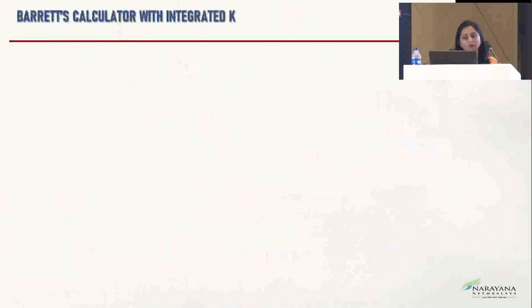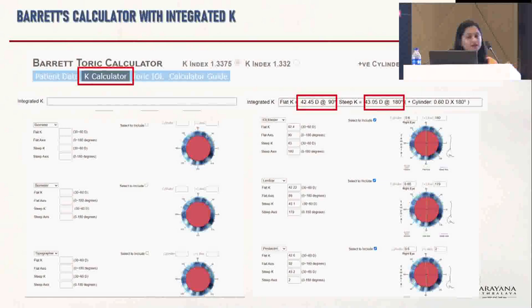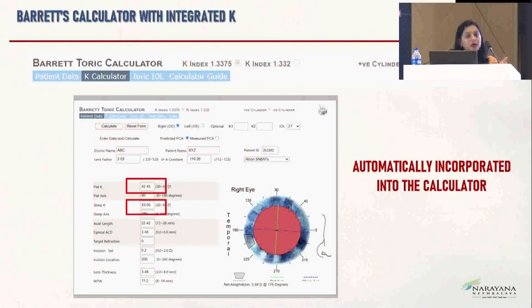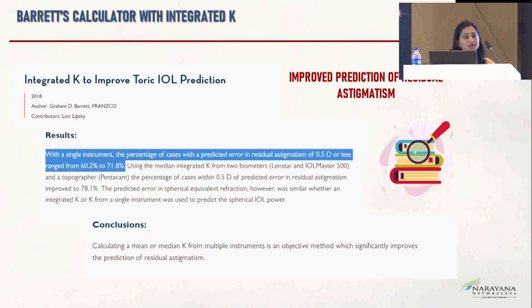If you go online, these are all freely available. If you type Barrett-Toric calculator, you get the K calculator below. You can see that you can enter all three values. The top two, if you can see the cursor, are the biometers and the bottom is the topographer. Once you enter the values, the system automatically incorporates the actual K into your calculator. So you don't have to decide which K value you need to put, whether your IOLMaster is better or the Pentacam is better. The calculator by itself chooses and automatically incorporates it into your calculation. There have been studies which say that it is statistically significant and comparable to the Barrett calculator.